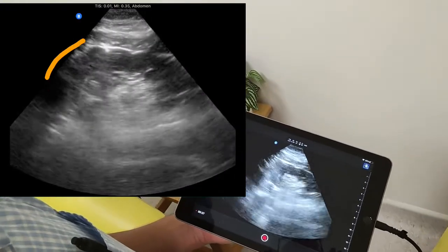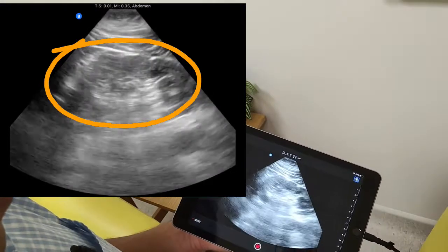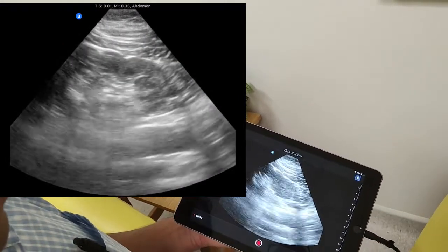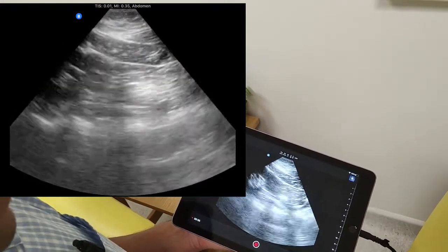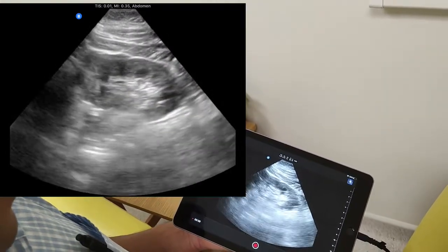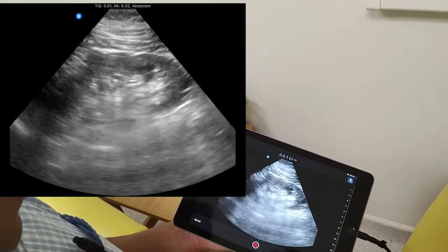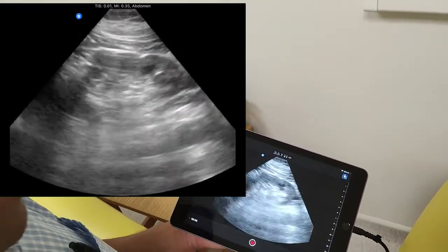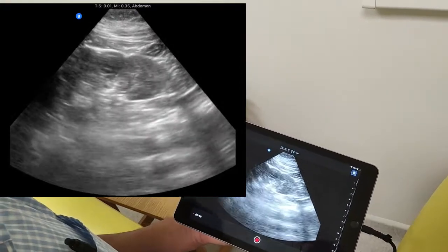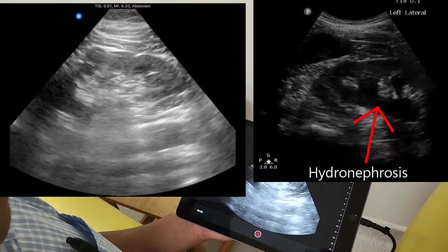So, just looking at the kidney here, Ada, if you could take a deep breath for me. You can see the outline of the kidney just appearing, and I'm fanning through the whole kidney. What I can see is that the cortex, the medulla, and the calyces all look normal. There's not a huge amount of distended, black, fluid-filled calyces, which you'd expect with hydronephrosis.